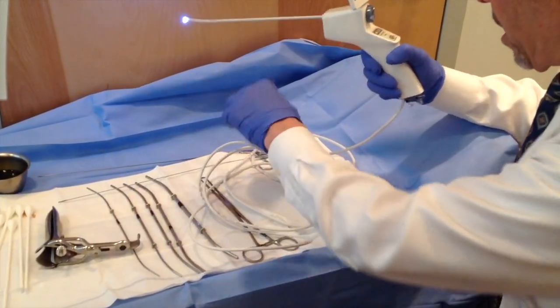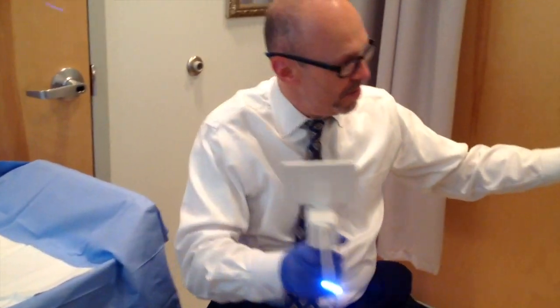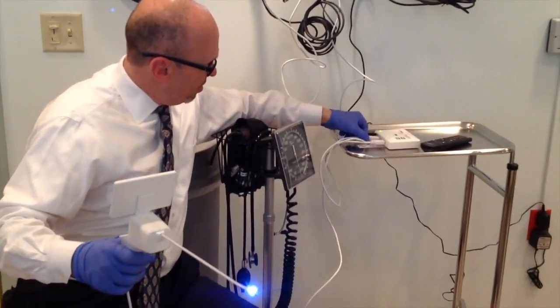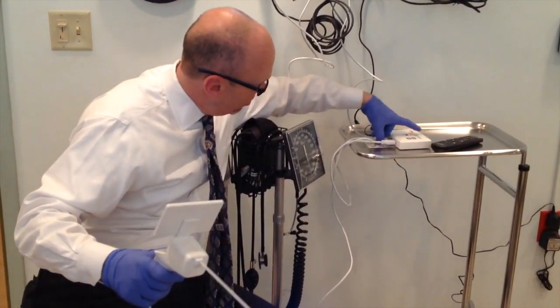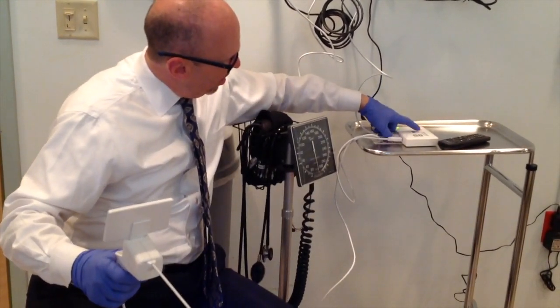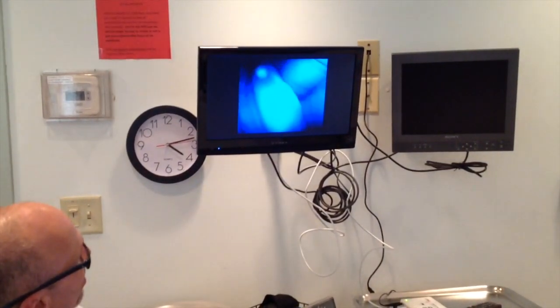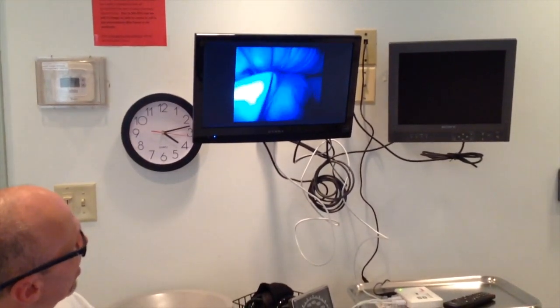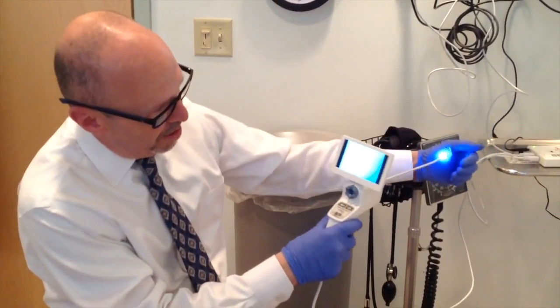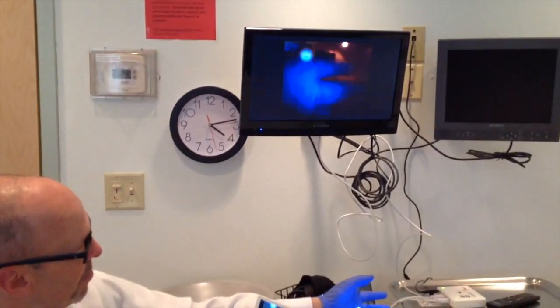If we want to look at it on a bigger screen, record it, or let the patient see it — since this is all sterile — we'll pass this off and my assistant will plug this in. We'll do it here today because it's not sterile right now. There are USB ports right here for recording and storage. And now you can see what it looks like on the screen — this is what it looks like inside. The patient watches that, and I'm watching it on the screen. It's a beautiful picture. You can also record videos.